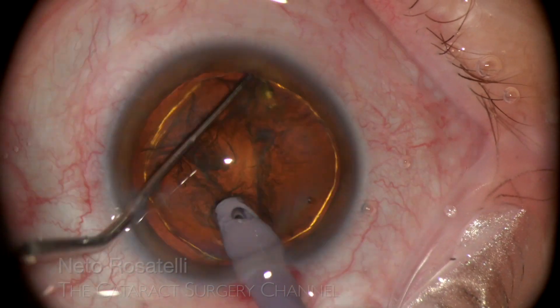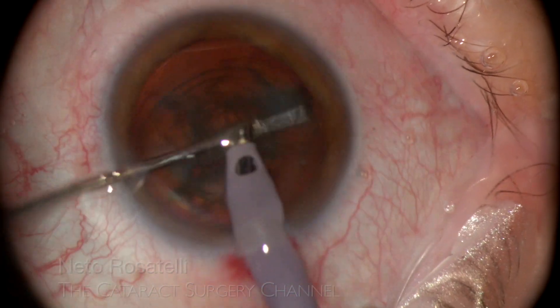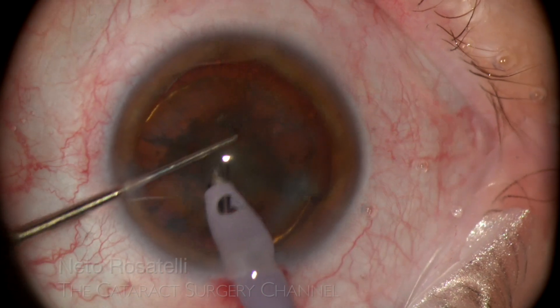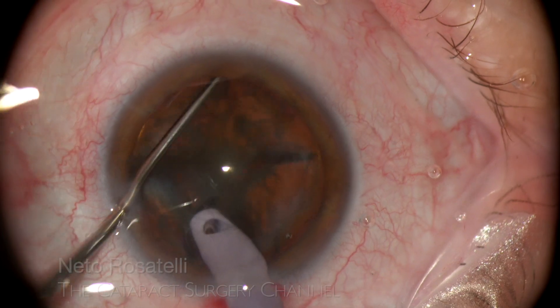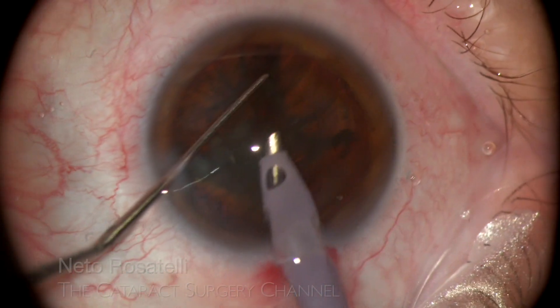Here the nucleus is of medium density and the wedge mechanical chopping technique is used to mechanically fracture the nucleus into 4 pieces with no ultrasound or fluidics.